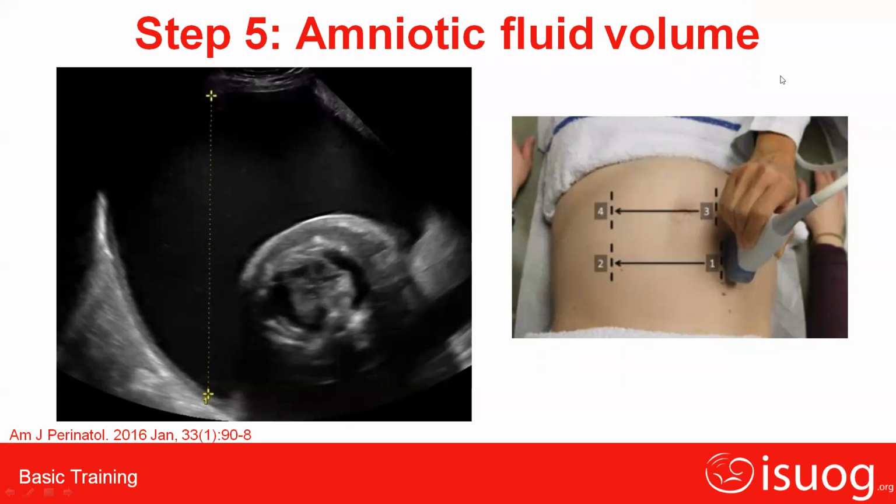If there's an intrauterine infection, what do we do? Then we have to investigate completely and find out the type of intrauterine infection. By itself, the amniotic fluid index would not mean very much, but you'll have to go through whether this patient has ever been evaluated for cytomegalovirus or toxoplasmosis, whether she has ever had any serial evaluation for that, and whether there are any associated signs. Otherwise, of course, you might even require an amniocentesis to assess, which is very tricky because there is already less amniotic fluid, and we have a high chance of a fetal demise. But it's nice to go over the entire clinical picture and find out about a history of rash, etc., because rubella, cytomegalovirus, and toxoplasmosis, all three are associated with less amniotic fluid.